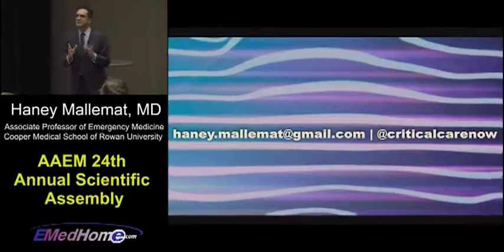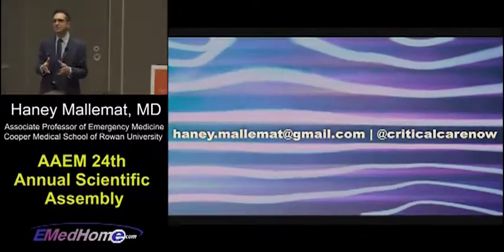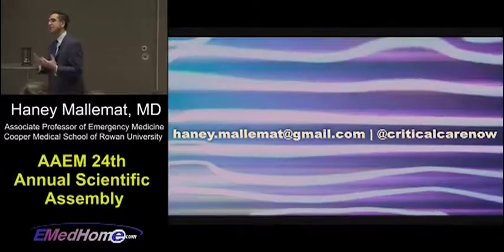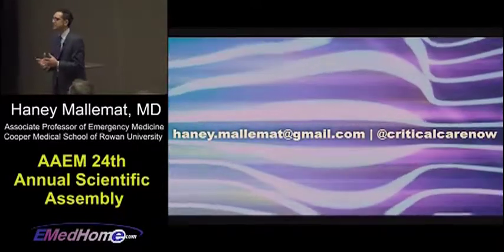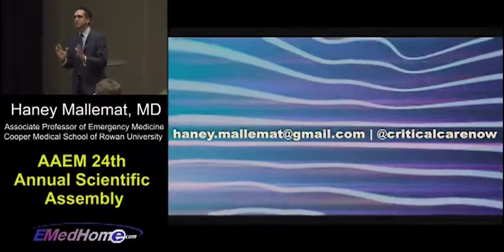So I hope you found this helpful to use end-tidal CO2, not just for ventilations, but for assessing cardiac output and metabolism. End-tidal CO2 is a rapid and non-invasive tool that you can use at the bedside for your critically ill patients.